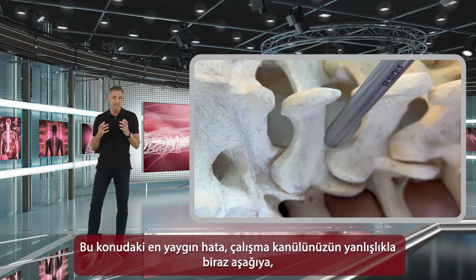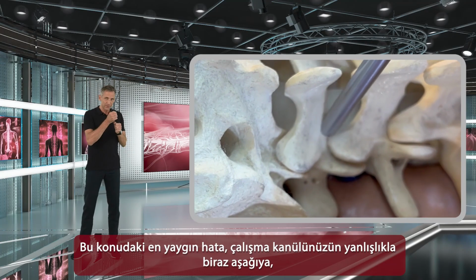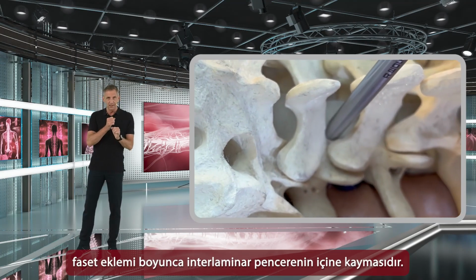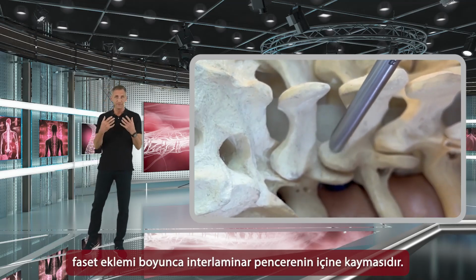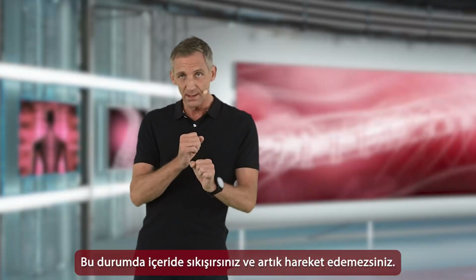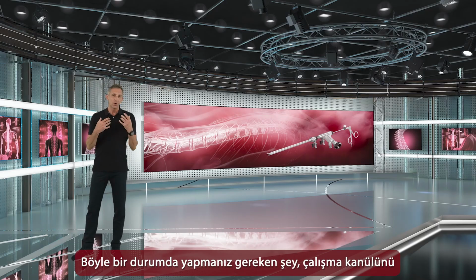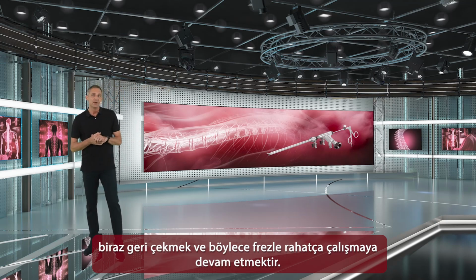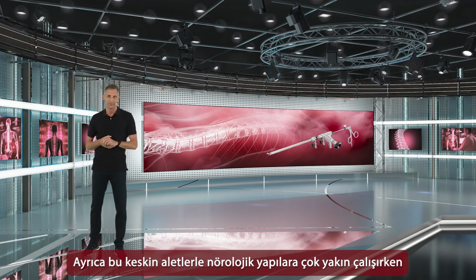The most common mistake in this respect is that you accidentally slip with your working sleeve just a little bit lower into the interlaminar window along the facet joint, and now you're stuck inside the interlaminar window and you can't move around anymore. So this is when you have to pull back the retractor, the working sleeve, a little bit, and then you can continue working easily with your burr and you can move around.